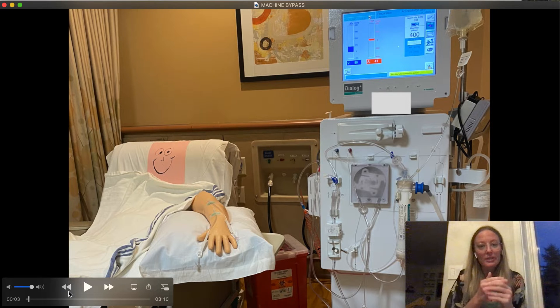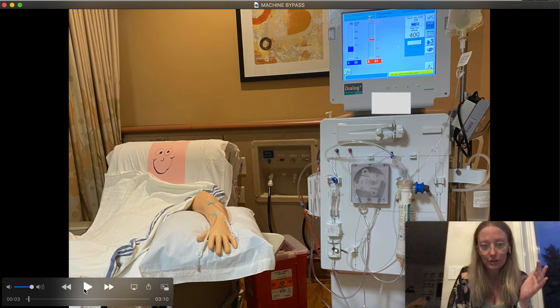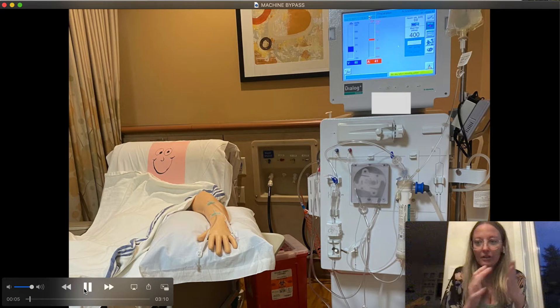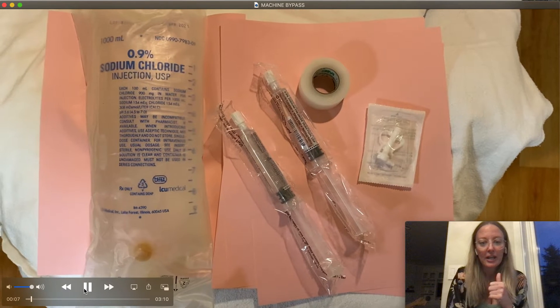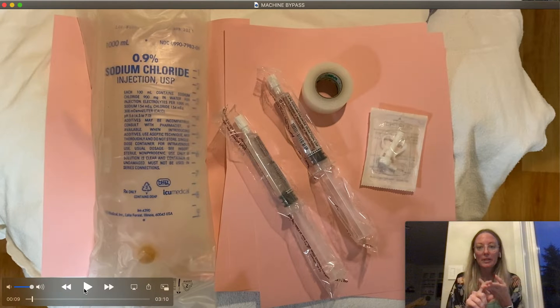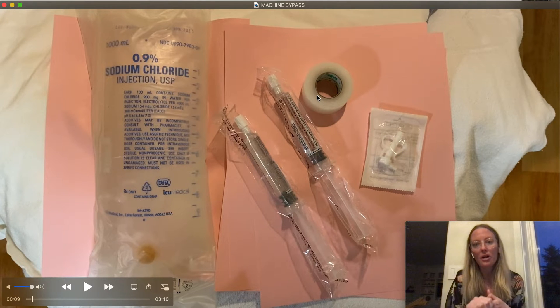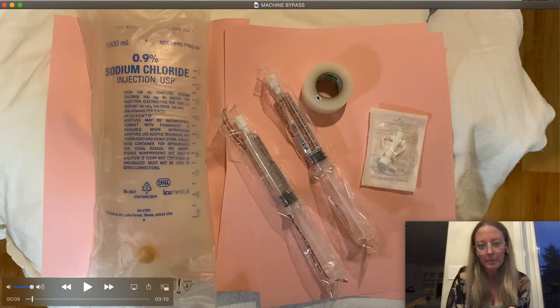Mr. Pink says that he has got to go to the bathroom. Usually when they have to go to the bathroom it is urgent, so you want to have practice and get good at doing this. Some of the supplies that you will need: a saline bag, two syringes, a recirc peanut connector, tape, and I would also add alcohol wipes to your supplies list.